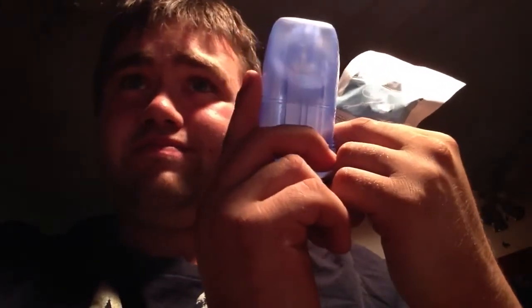These, all together, a box of 10 of these, comes to about $185. So this right here, along with this, is $18.50, and that's pretty expensive for a pretty small piece of plastic. So what I am going to do here is just take the plastic off, and take this end thing off here.